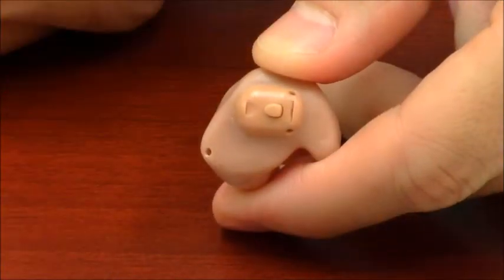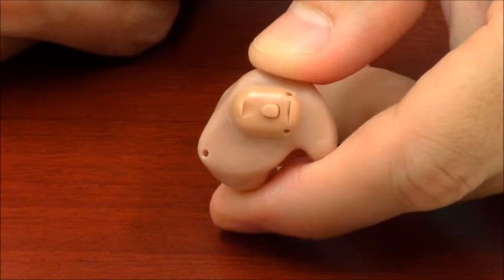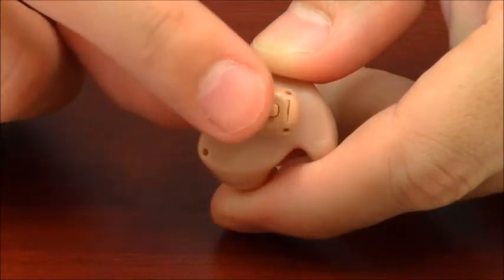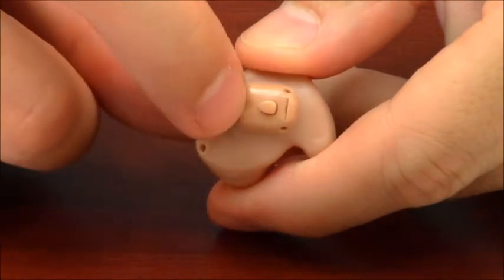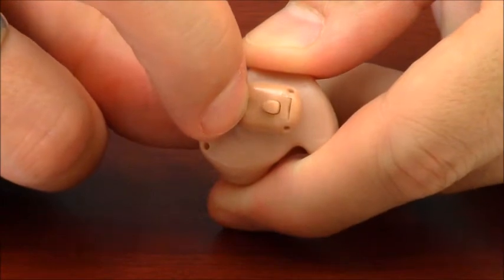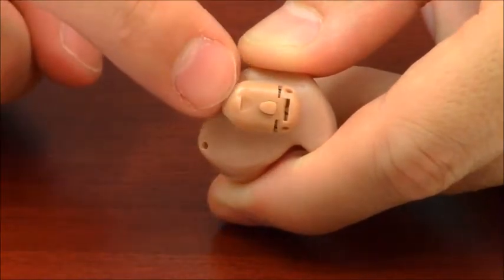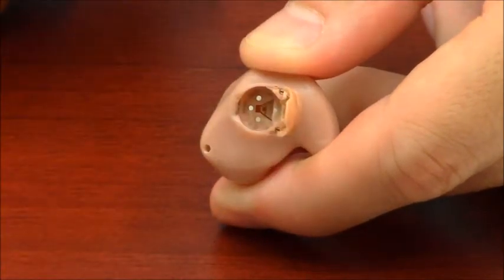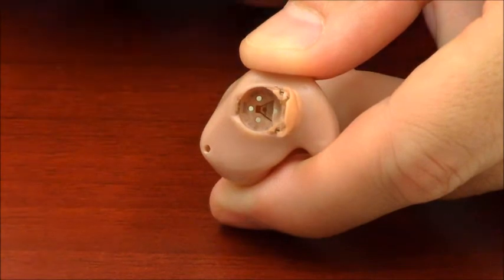Another style of battery door is the flip-top battery door. So to open this style, basically again you want to find the ridge on the faceplate of the hearing aid, and with your finger or your nail, this time you want to pull out, and you'll hear a little click, and you'll be able to flip the battery door open. With this style of hearing aid, it's very easy.